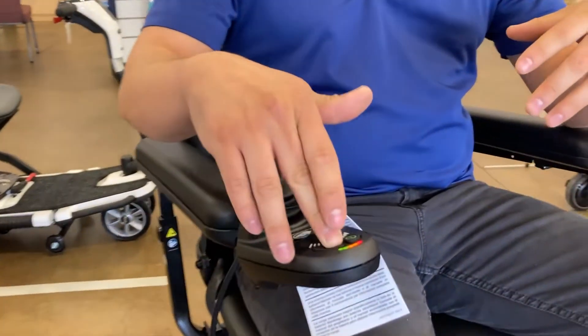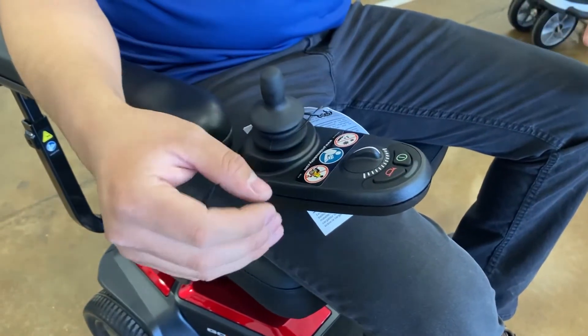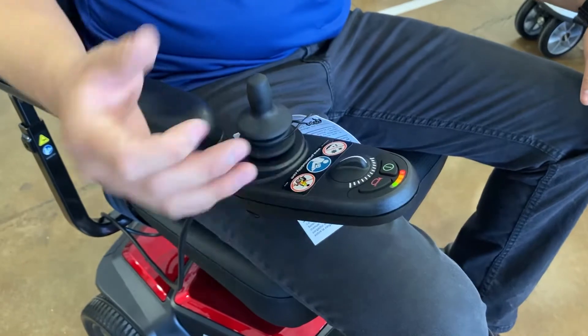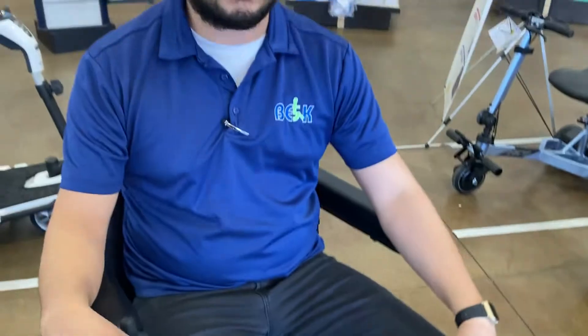Let me show you how this chair operates — very simple. We have your horn, your power button that turns the chair on and off, and of course you have your speed. Then you have your stick that goes ahead and moves you. You also have your lights right here that show battery life — kind of gives you an estimate of how long you have left on the battery. Let me show you how easy it is to maneuver and the sharp turns you can take.